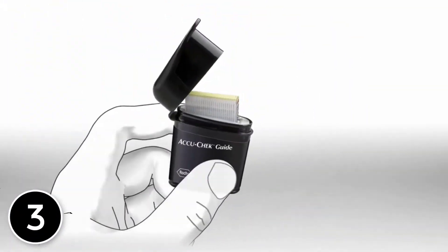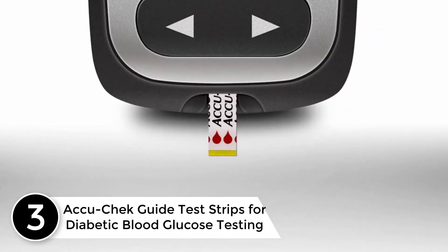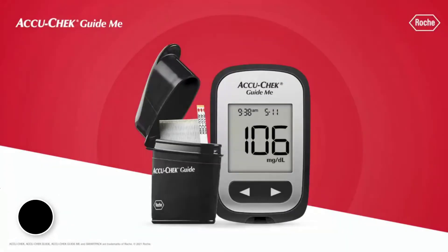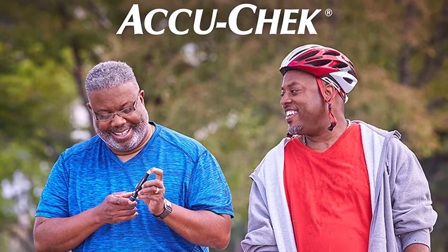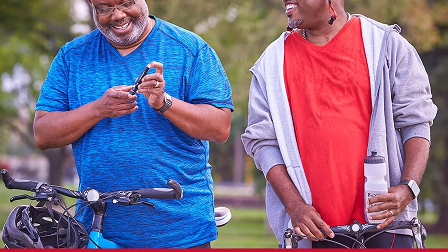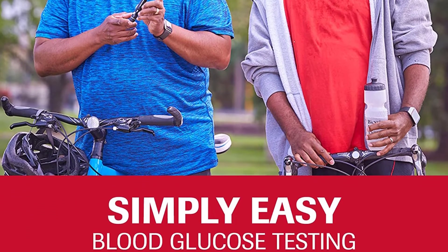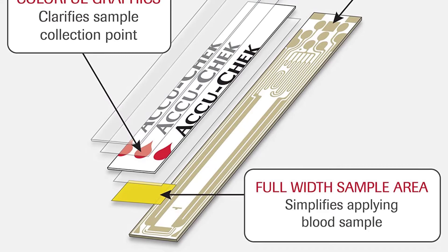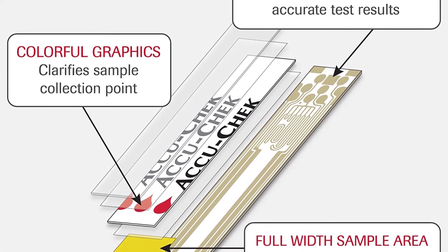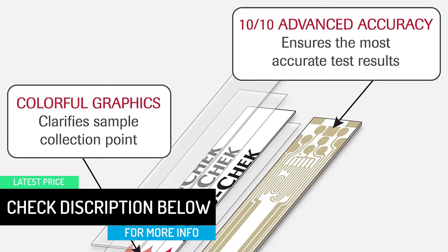At number 3: AccuCheck Guide Test Strips for Diabetic Blood Glucose Testing. No matter what type of diabetes you have, the AccuCheck GuideMe system incorporates simple conveniences that provide a better testing experience. Our meters, test strips and control solution take the hassle out of managing your diabetes. Roche Diabetes Care Inc., the maker of AccuCheck products, is a leading provider of blood sugar monitoring systems with more than 40 years experience, and their goal is to help people living with diabetes have better control of their health.